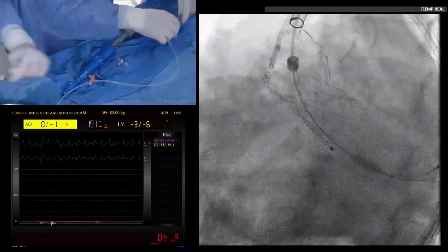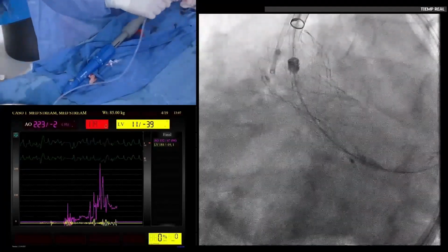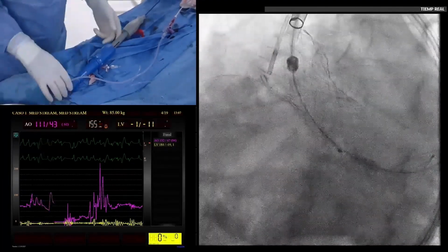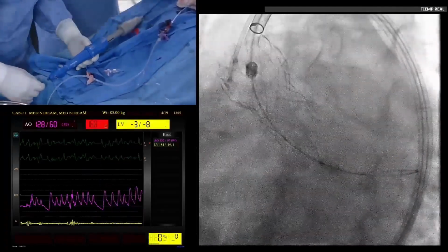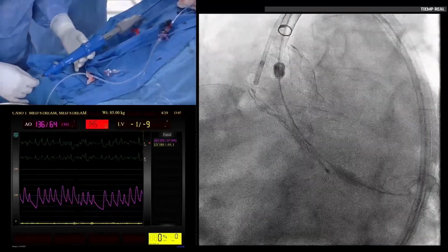So sometimes we can be very precise, very gentle to change position. But like yesterday, when we did a patient with 10% ejection fraction, we had to decide to deliver the valve as soon as possible because if not, you might not have a patient.